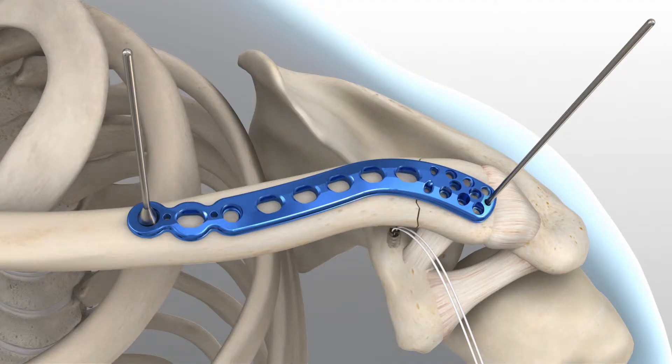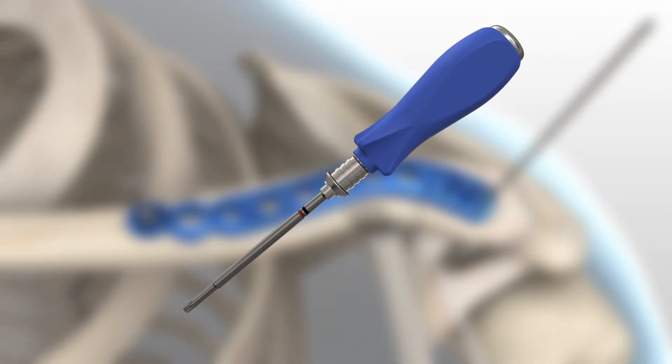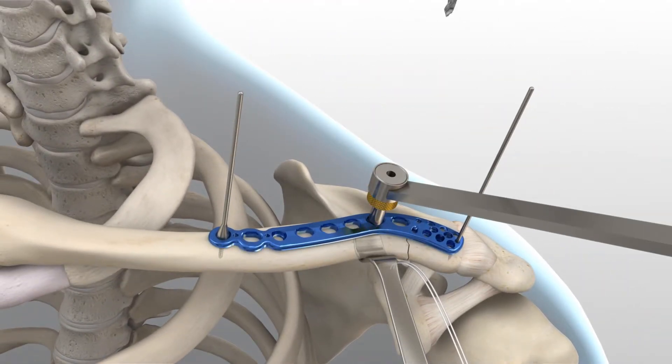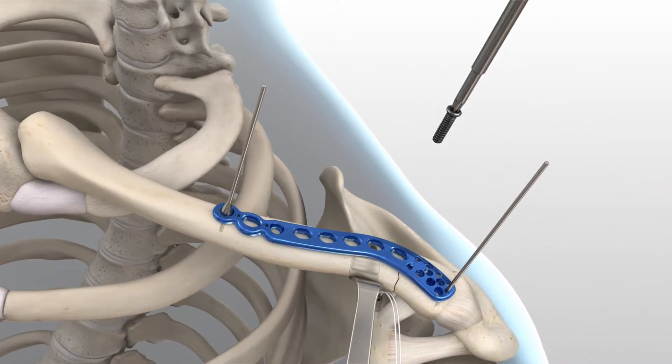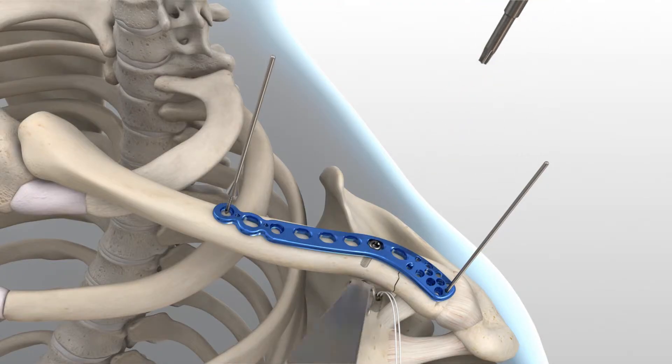The clavicle retractor should be placed under the inferior surface of the clavicle to protect the neurovascular structures from overpenetration when drilling. To insert the proximal screws along the shaft, assemble the driver to the driver handle. Using the 2.8 mm drill and drill guide, drill then measure for depth and place a 3.5 mm non-locking screw through the slots. 3.5 mm non-locking hex or hexalobe screws can be used in the slot.